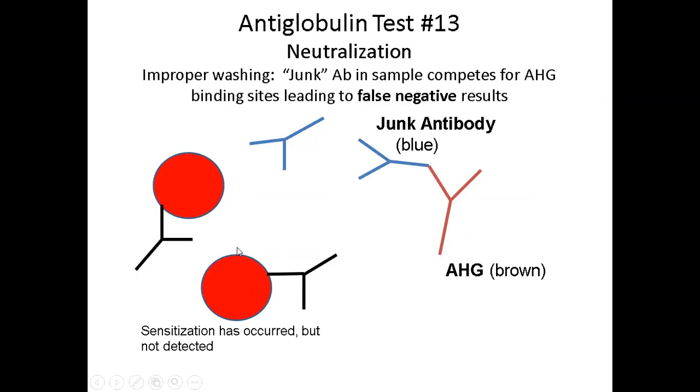Now, we talked about how it's very important to wash properly before we add our AHG. And in student lab, we always wash 3 times. And what we're washing with, maybe I didn't mention this to you all before, is physiologic saline, because that is something that is not going to adversely affect the cell membrane of the red cells and cause hemolysis.